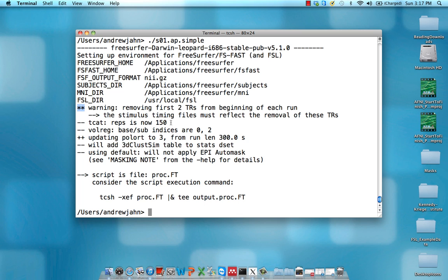In this example, if these timing files were not already adjusted, we would subtract two TRs from them. A TR in this experiment was two seconds, so two times two seconds would be four seconds that we'd subtract from each event.